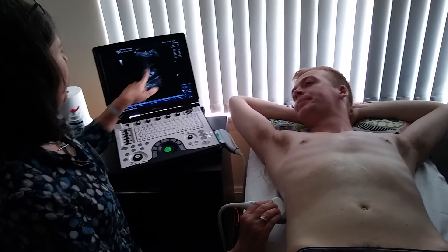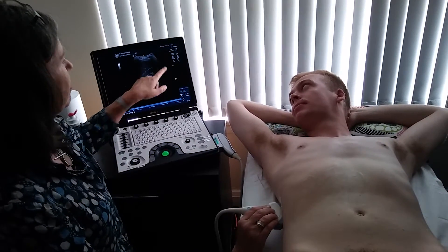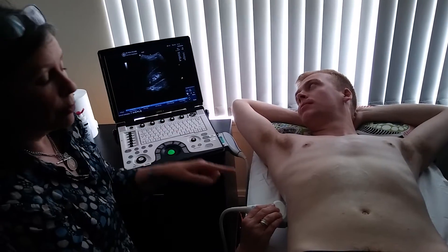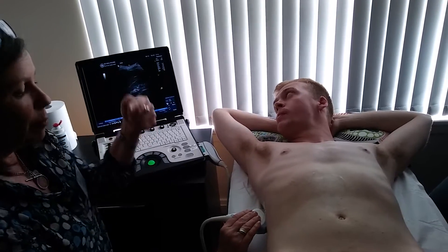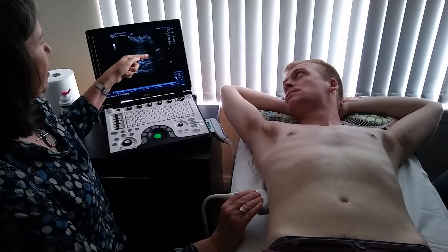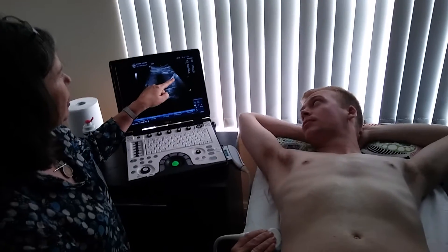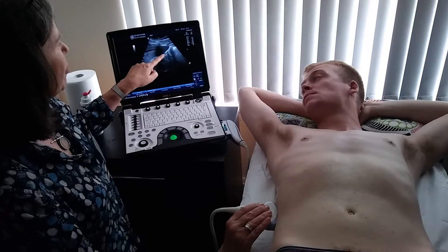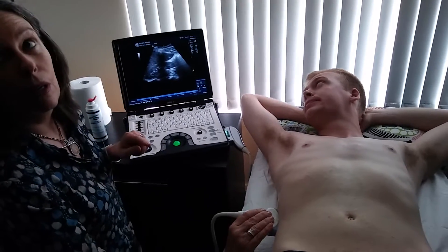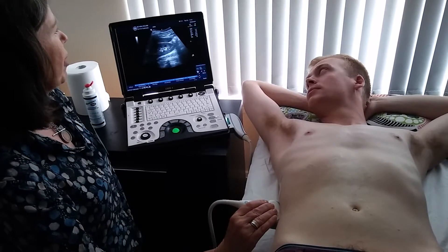The fluid doesn't just go straight down here - it's got a pathway to get to. Sometimes it's still traveling down that lower edge of the liver. So what I'm going to do is slide - this is his head, this is his feet - slide the probe towards his feet. That's why I had some gel on him. And you can see now this is the liver tip. The fluid might still be traveling around the lower edge of the liver before it starts heading to Morrison's pouch. So I really want to find this little edge - there's my kidney still - and I'm just going to sit there and fan. I'm pretty confident that there's no fluid there.